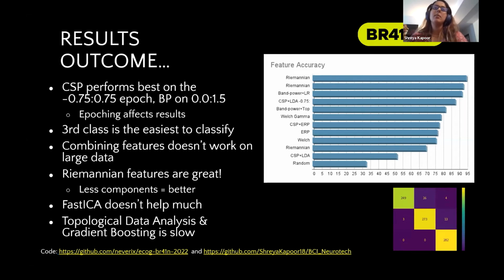And here we used ensemble modeling, in which we try to combine as many configurations as possible of the pre-processing, feature reduction, and the classifier. The best performance that we got was for the Riemannian features and classifier.